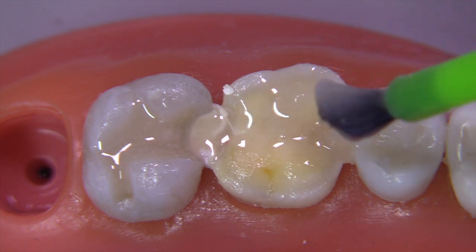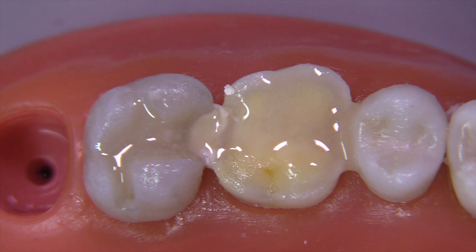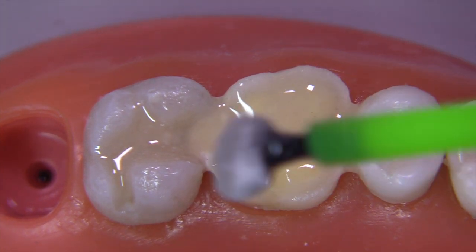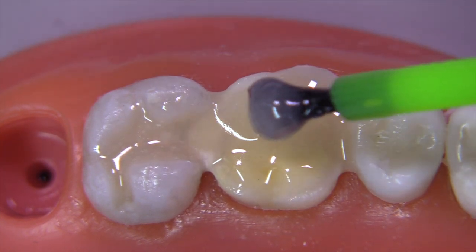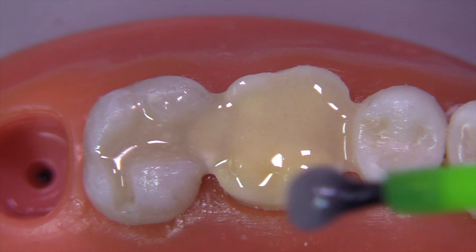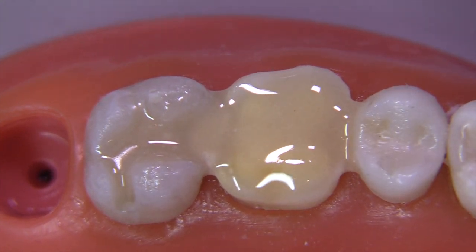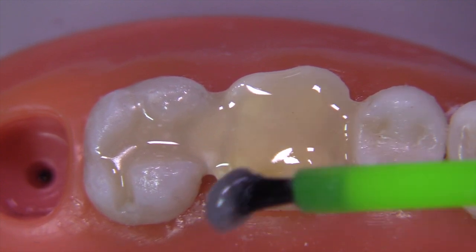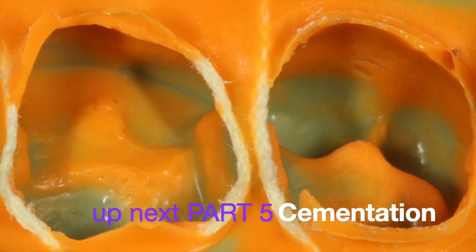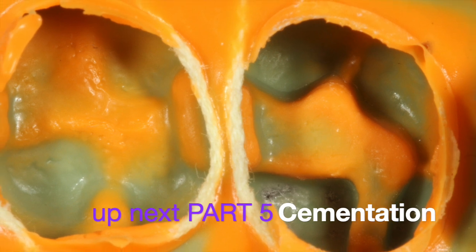We paint this product using the liquid-powder technique over the surfaces of the preparations. The teeth won't be sensitive because IDS keeps the dentin well sealed, and because we've used Vaseline on top of the IDS surface, this material will not stick. If you don't use a thin layer of Vaseline, your provisionals will bond to the teeth as though they were permanent restorations and you'll have a miserable time removing them at delivery. We'll discuss the modifications required at delivery to reactivate that surface for bonding. For now, have the patient bite down to form the temporary — they won't be able to floss but the tissue will remain remarkably healthy. In our next section we'll talk about cementation. I'm sending this to my laboratory for two E.max restorations and we'll pick up the discussion at that time. Thank you for your attention.